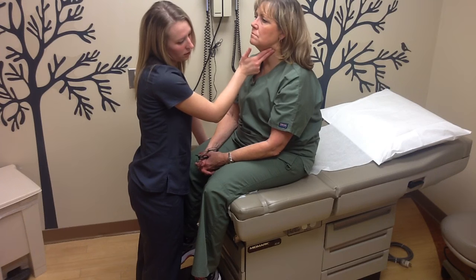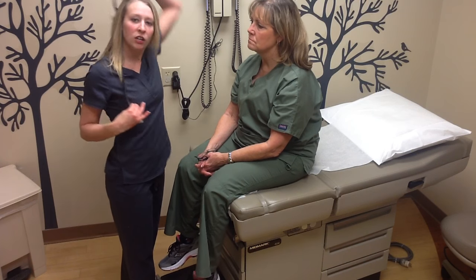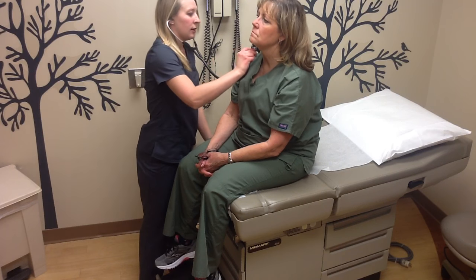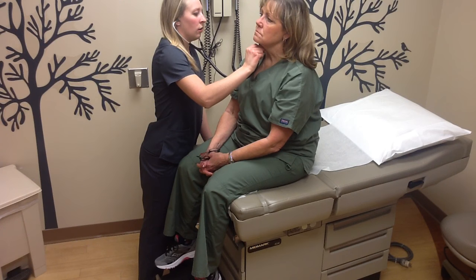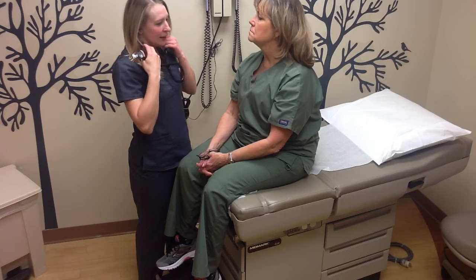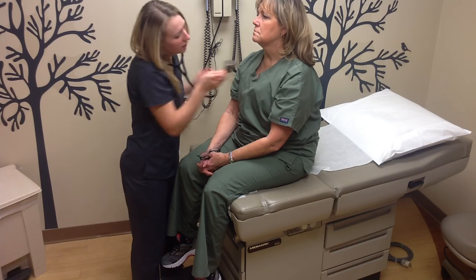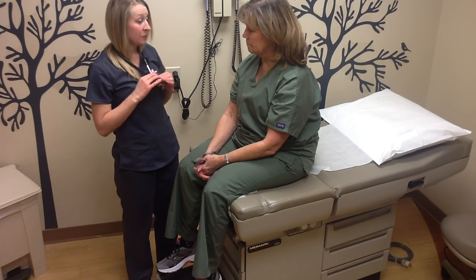Good. Strong pulse on both sides. Next I'm going to listen for any carotid bruits. Go ahead and take a deep breath and hold it for me. Good. And again. Good. No swishing sounds heard on exam there, which is a normal finding.